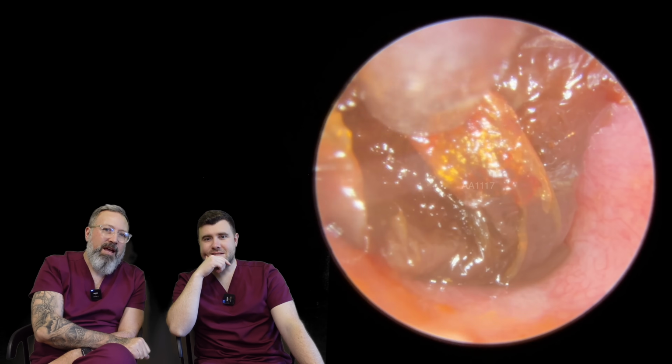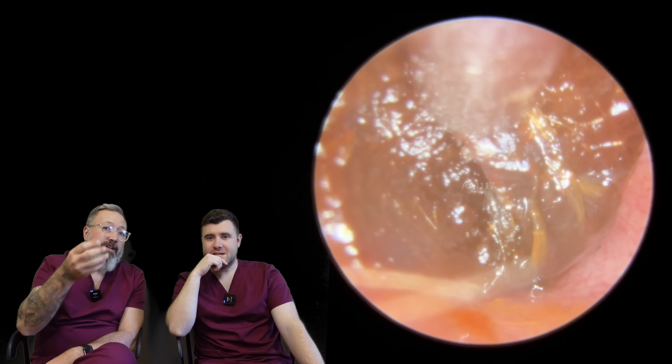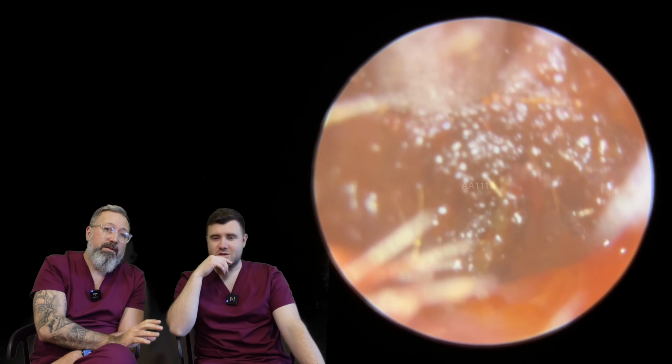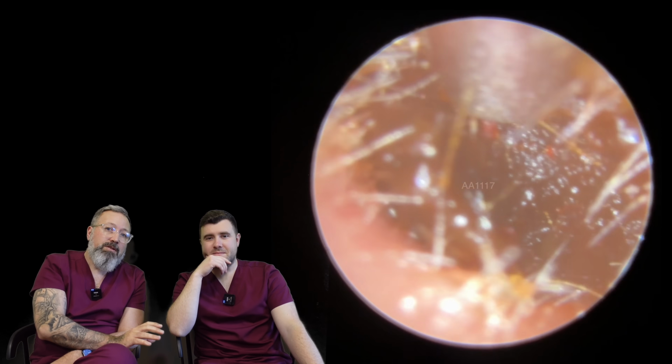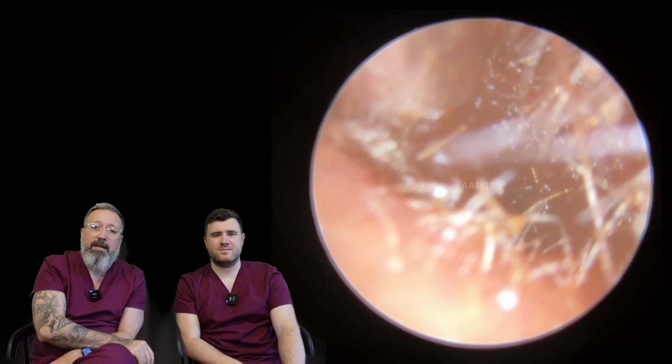I think what happened at that point, I got a grip on it, and as I lifted, one side sheared off and flicked into the suction tube, and there was a little bit of clarinetting. That's what caused the patient to flinch a little bit. Just a little bit. So we're just going to pull this section down. Similar story on this side, narrow canal again.